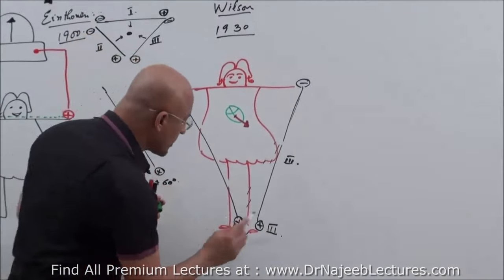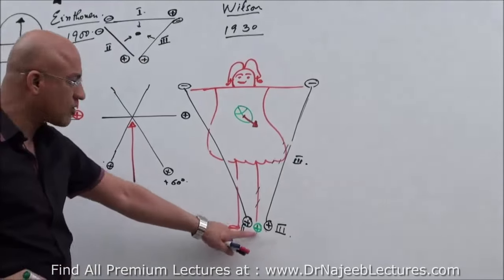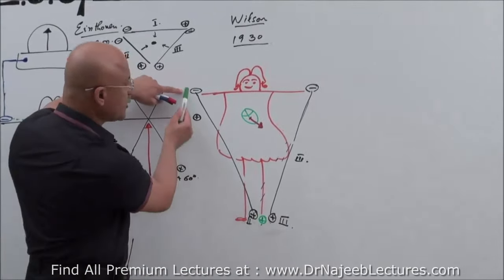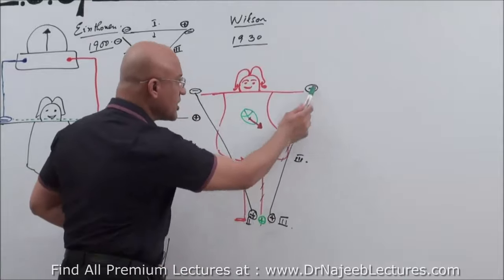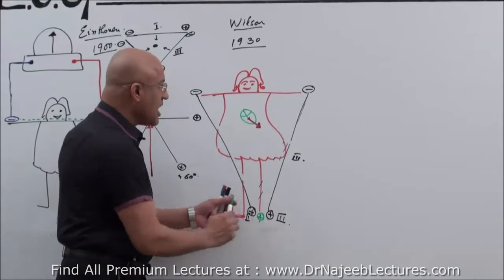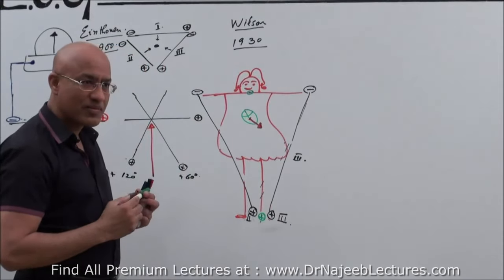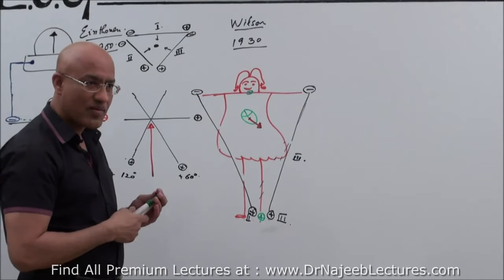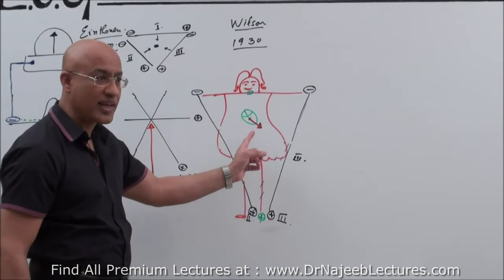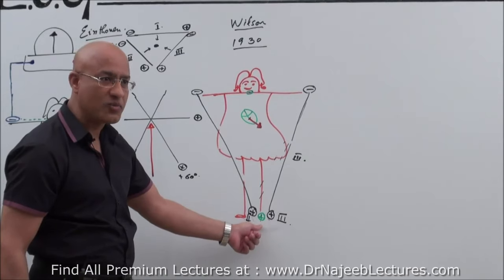Now, Mr. Wilson wanted to make another lead. He said, I want to put the positive here. Positive electrode of the machine will be put here. But he was having a trouble. When he put negative, lead will look in this direction. If he put negative there, lead will look in their direction. The easiest way what he could do was, he put positive here and put the negative here, and it could become a straight up. You are understanding? He wanted to look 90 degree from up. This was the Wilson lead at this point.